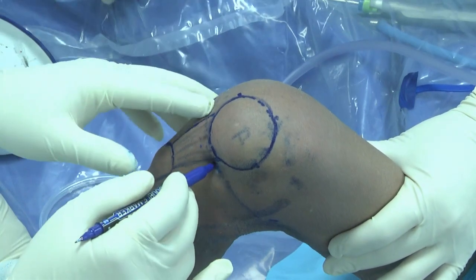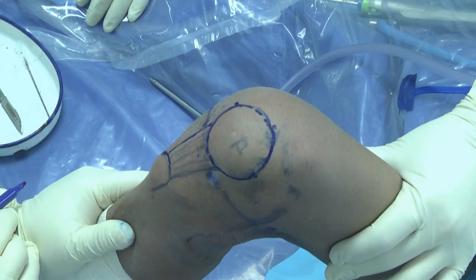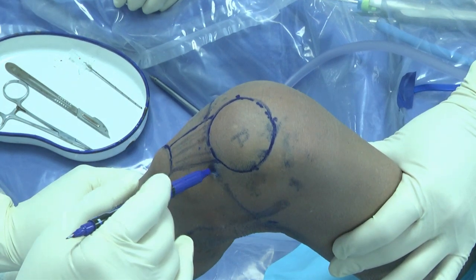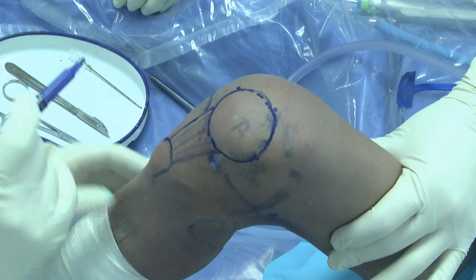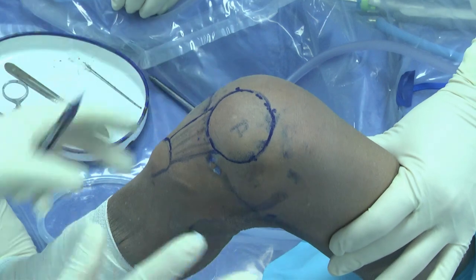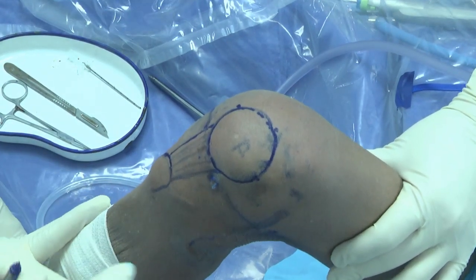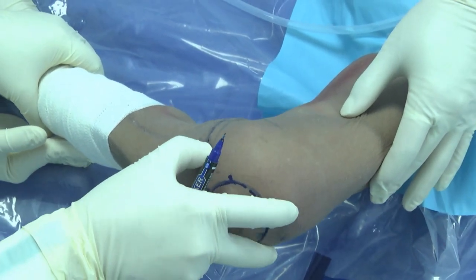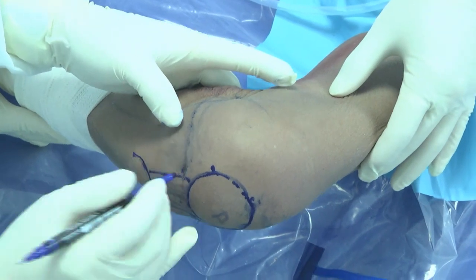Now that we've introduced all the commonly used portals, next we enter the joint and do a series of operations. The anteromedial and anterolateral portals are used in all knee surgeries, whether ACL, PCL or meniscus, because we need to go into the intercondylar notch. For meniscus surgery, my portal needs to be exactly on the joint line. So this is the joint line portal. I rarely change; I always use these two portals, medial and lateral, for everything: ACL, PCL, and meniscus surgery. I have no problem at all.